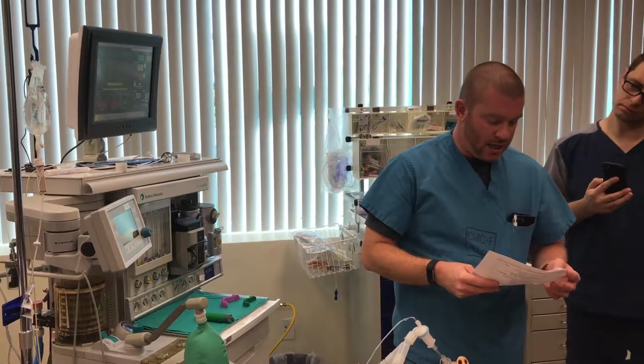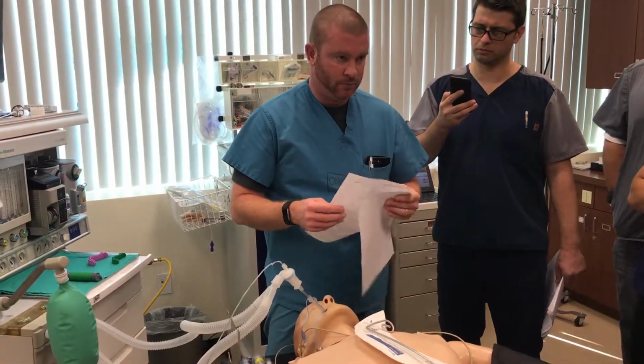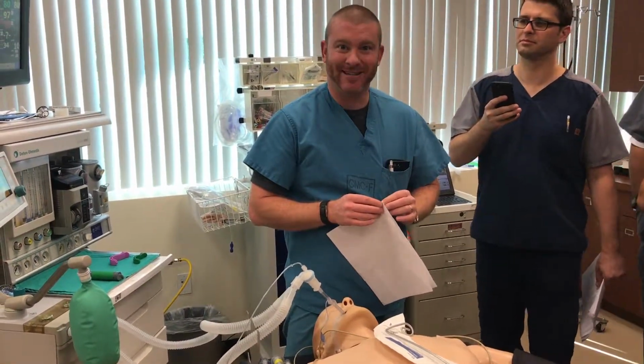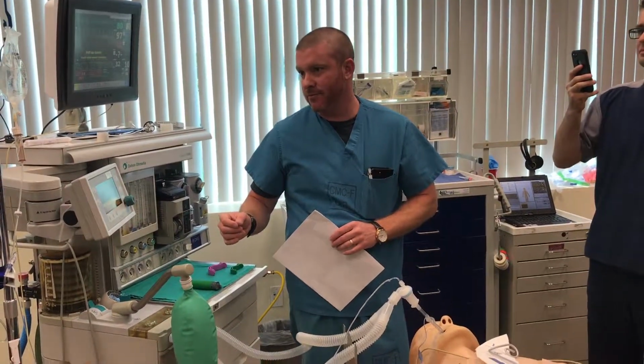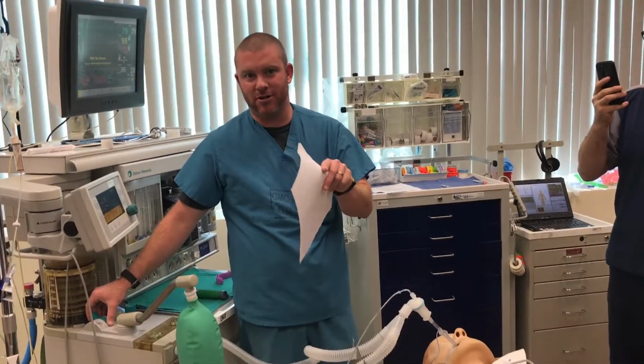I think so. We've intubated, we confirmed that, we secured the endotracheal tube. You're doing your first induction. Does that make sense? Now you do it. Questions? You all got it all? No questions? No questions, no questions.